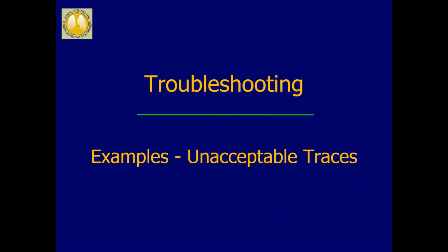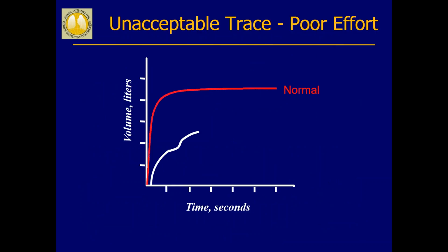And so I'll give you some examples of unacceptable traces. You can take a look at these and make sure that you look out for those.